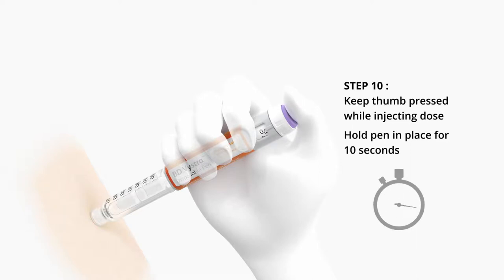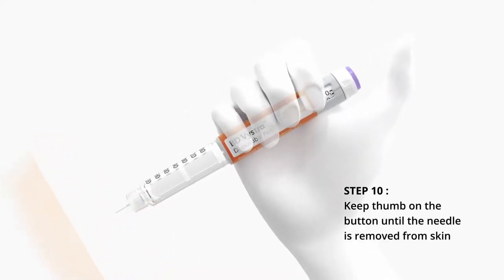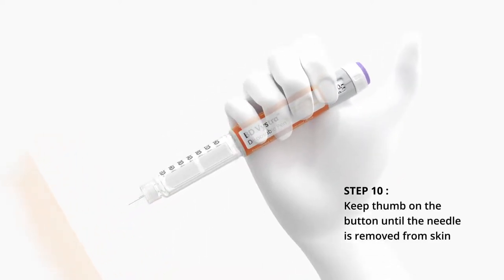Step 10. Keep thumb pressed while injecting dose. Hold pen in place for 10 seconds. Keep thumb on the button until the needle is removed from skin.